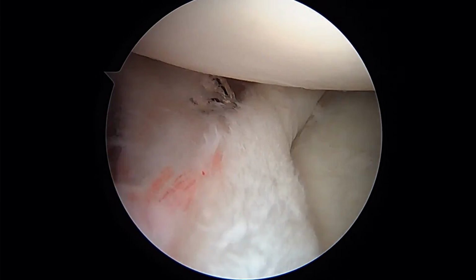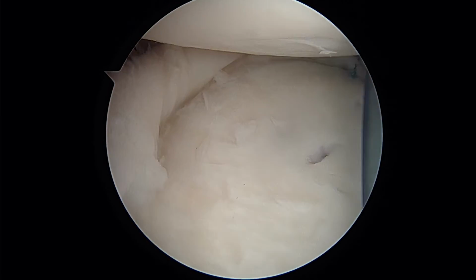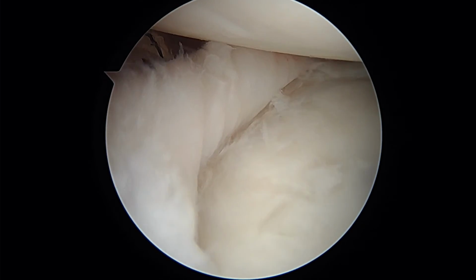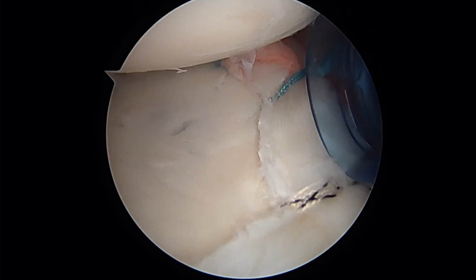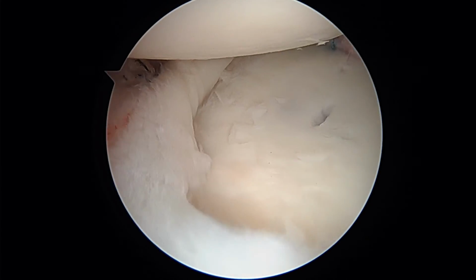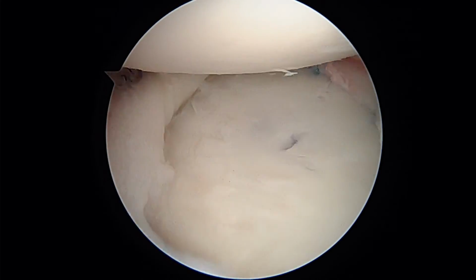Okay, we've placed a mattress stitch in the front to tighten up that anterior glenohumeral ligament. You can see that looks great. You can have a good look at the bumper even there. And I think the humeral head is pretty nicely centered. We had to repair this labrum in the back. And I think we're going to finish up here and get you back to the recovery room shortly, okay?